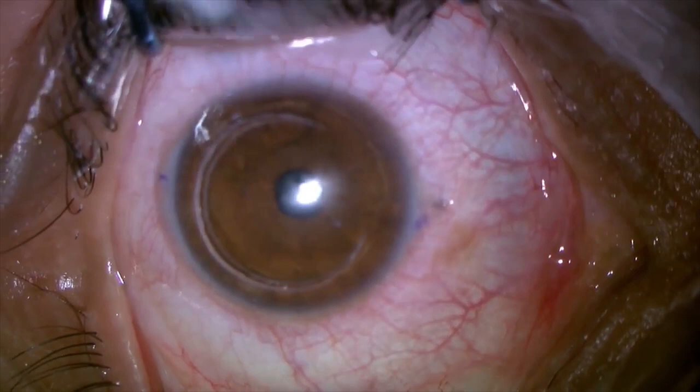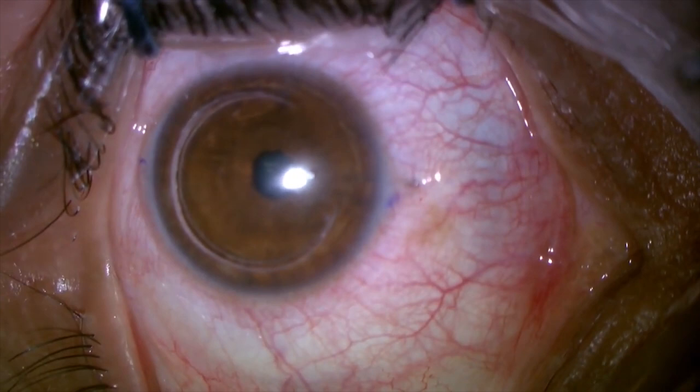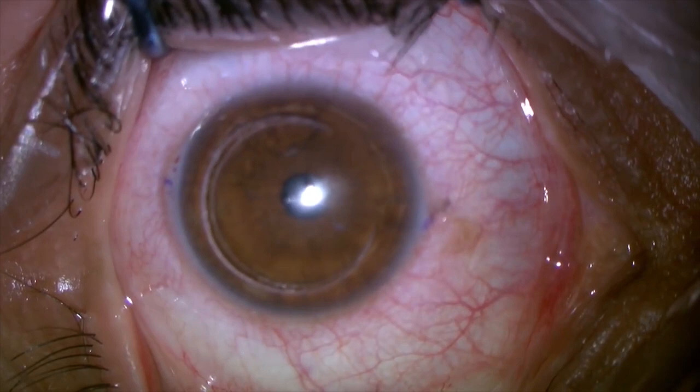So now we're going to do a paracentesis to lower the pressure of the eye. That'll enable us to suture the cornea in a much easier fashion. I'm going to make a little paracentesis over here and just let a little bit of aqueous come out. And that'll allow me to start suturing the cornea with good apposition of both edges. Inferior the suture.